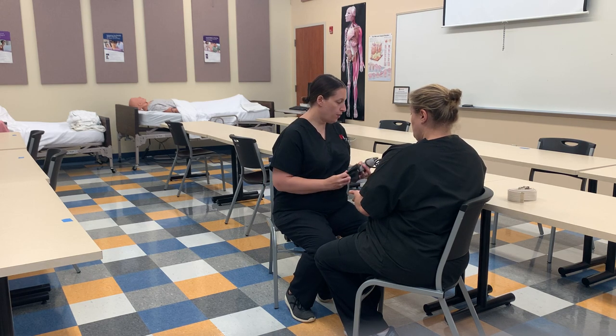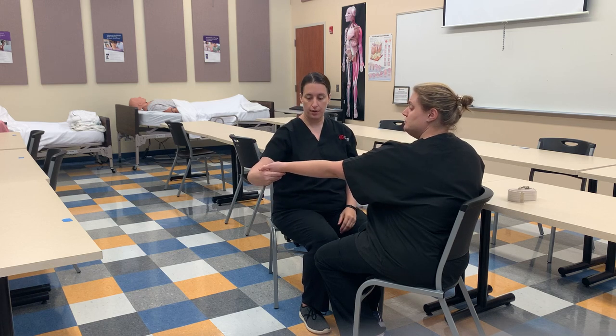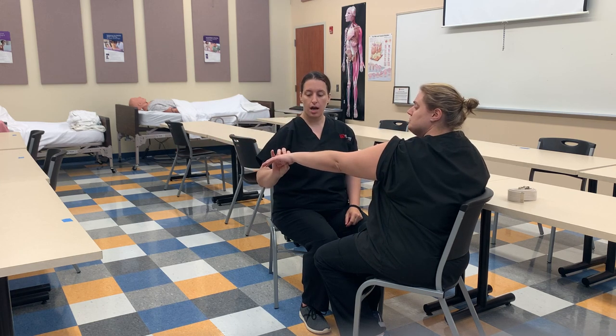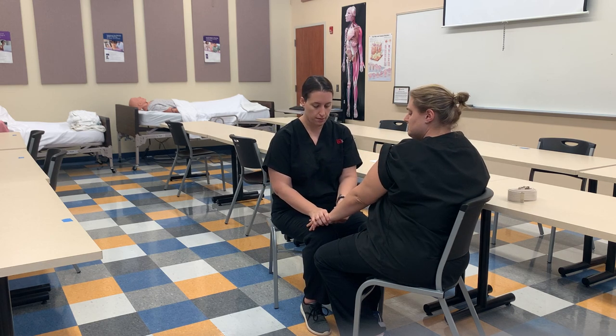Now we're going to check a radial pulse and then blood pressure. For blood pressure, I want the arm out this way because it's going to bring the brachial artery out. When I check a pulse, I want the palm down because it'll bring the radial pulse out. Up to bring the brachial pulse forward, down to bring the radial pulse out. We're going to find the radial pulse. We don't take a pulse with our thumb because that has a natural pulse to it. I look at my clock and count for 15 seconds, then multiply by four.